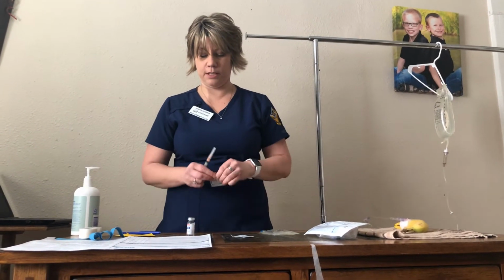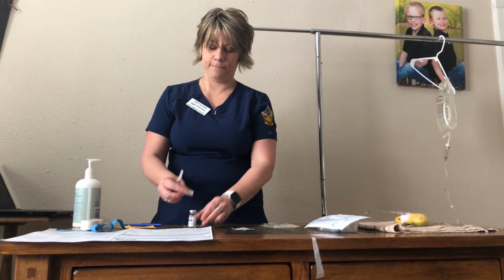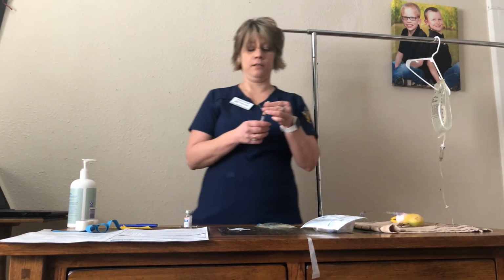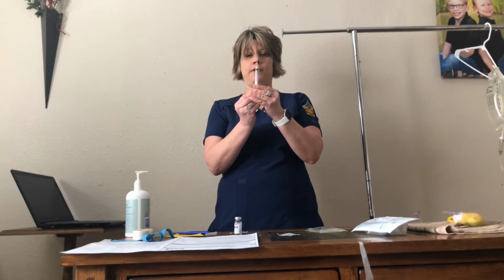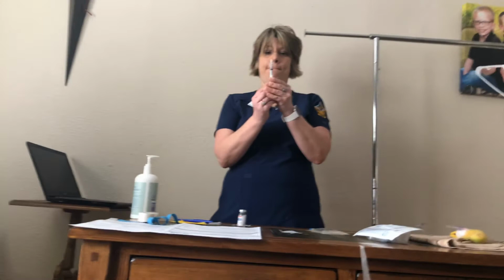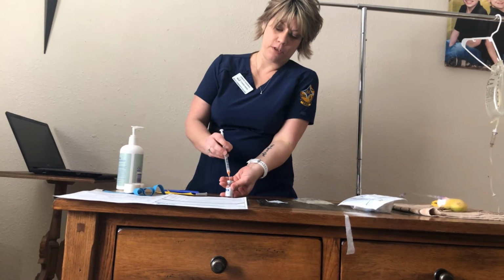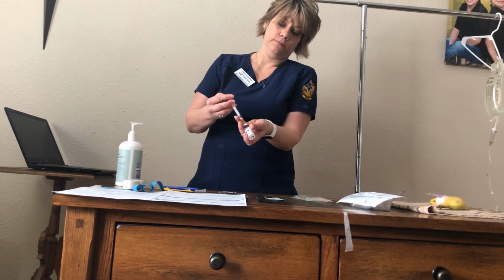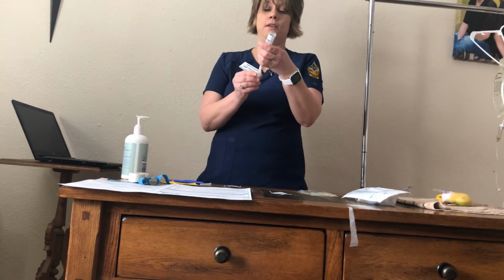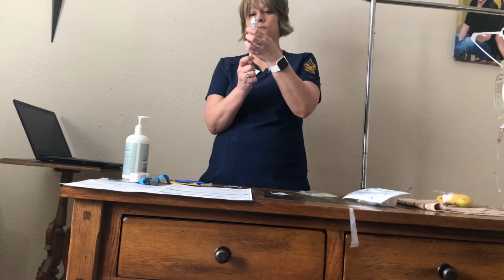Going to clean the top of it with an alcohol swab. Dispose of that. I'm going to draw up 3 milliliters of air. Inject the air. I'm going to draw up my 3 milliliters of medication.